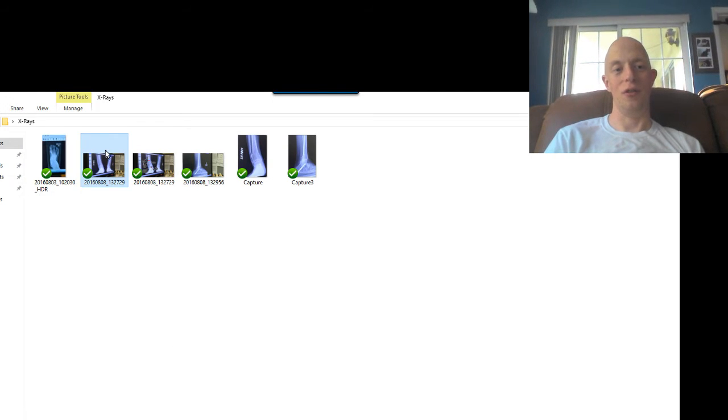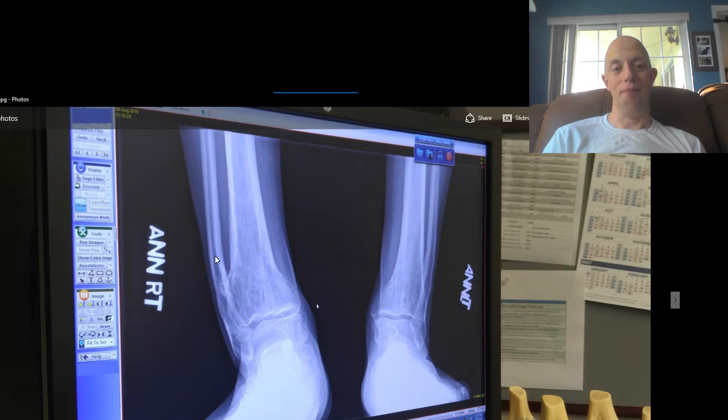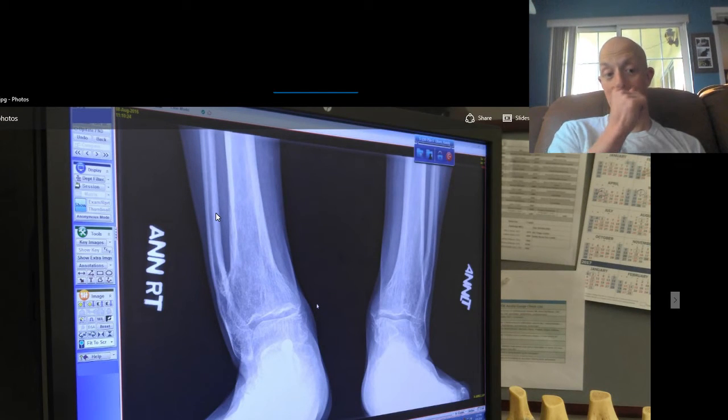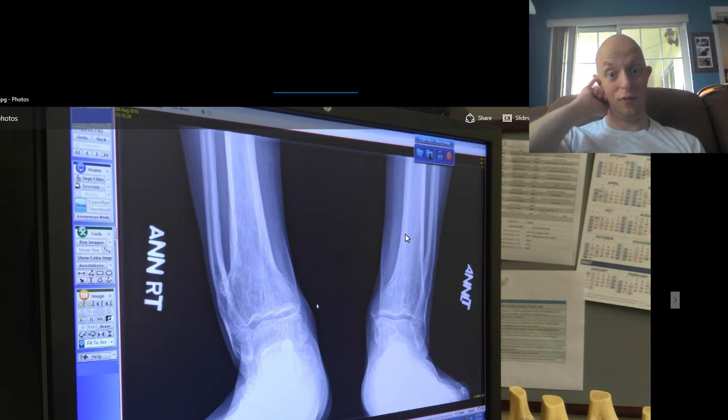Hey YouTube. We're going to be using OBS to basically review the x-rays that we have. The first x-ray is showing my right foot on the left side and the left side over on the right — so it's basically a flip-flop.